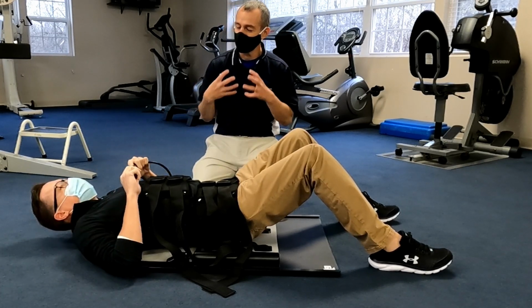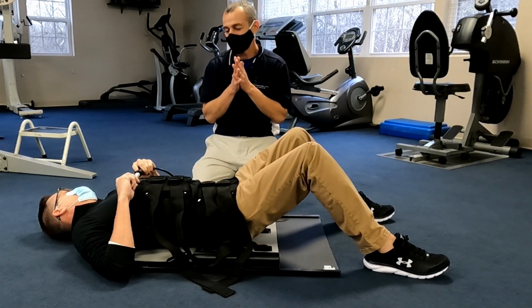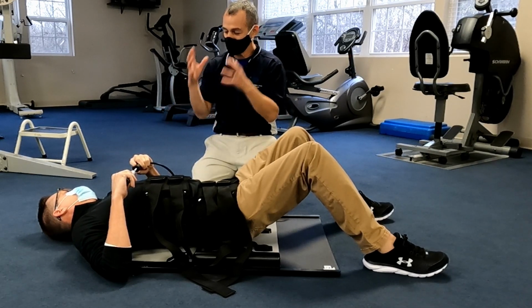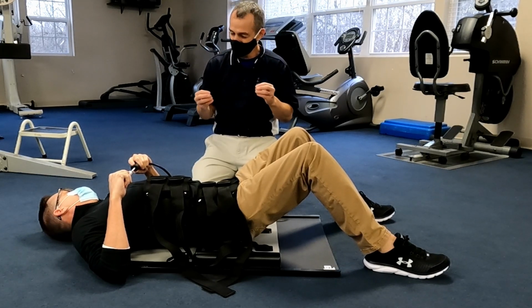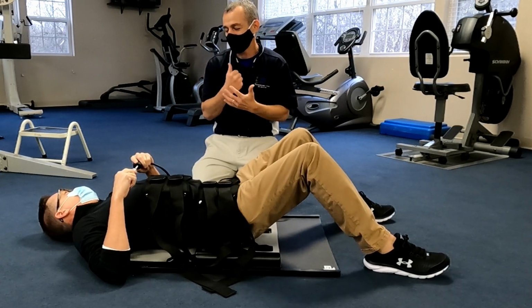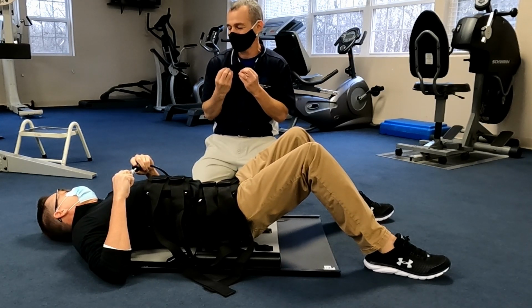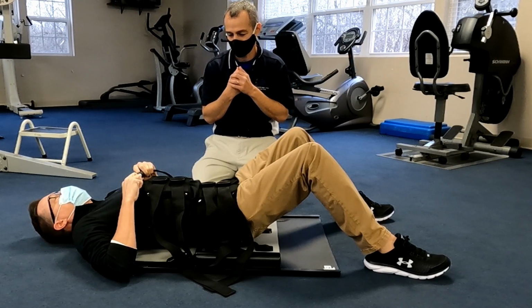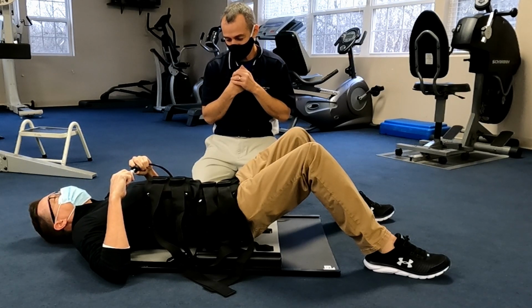So really slow, so you can feel the distraction. A big component of this, truthfully, is we want to manage the placebo as much as the mechanical. So the placebo is the sensation, the experience, what it feels like. If you do a slow pull, you'll feel that distraction. It's going to be more effective if you do it slowly and really focus on the sensation of it. Okay. So I can see it starting to move.